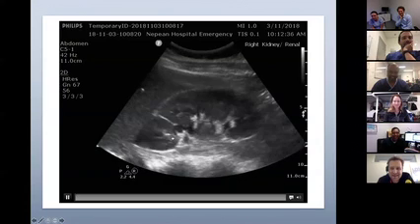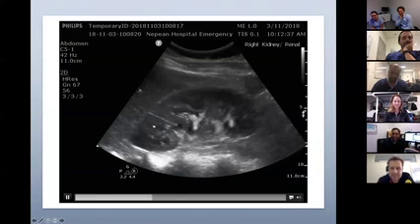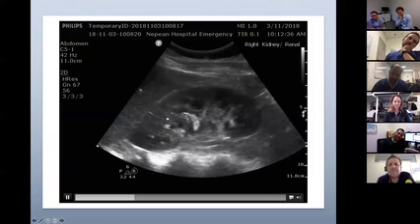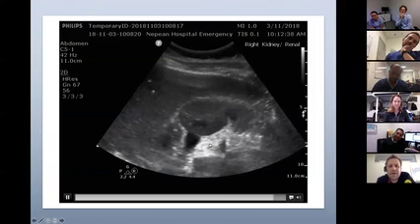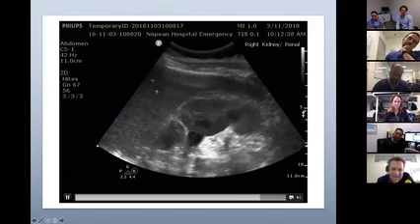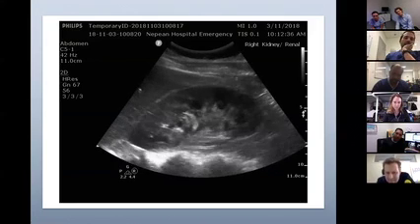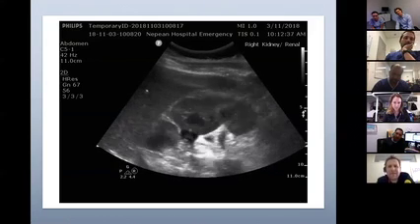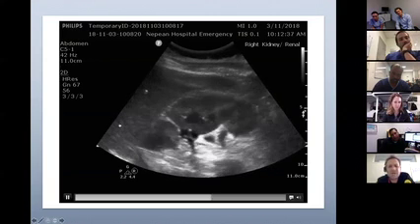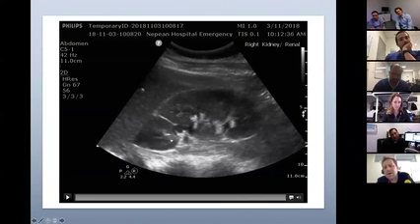So that's your kidney. Okay. So you tell me now in this view, where does the cortex finish and where is the medulla? In this area, can you see any differentiation there? Corticomedullary differentiation. Can you actually make it out? Even if I freeze it. There you go. So it kind of lost its corticomedullary differentiation, if you can agree with me.